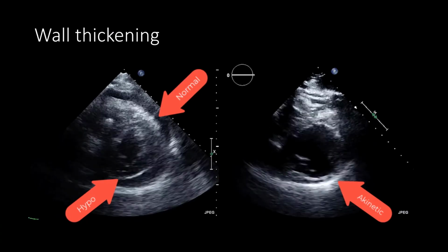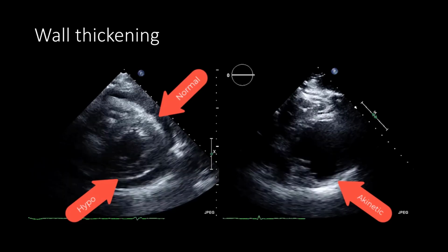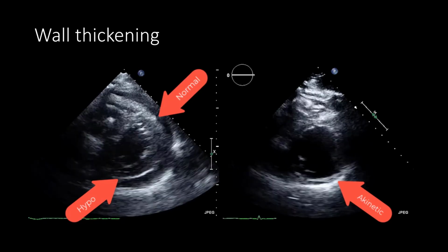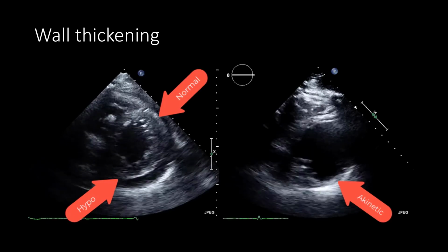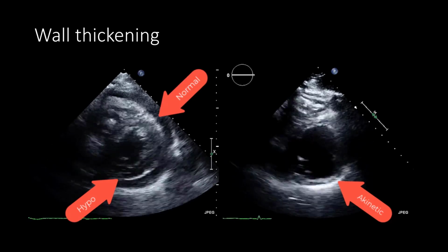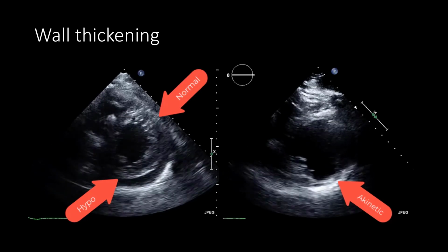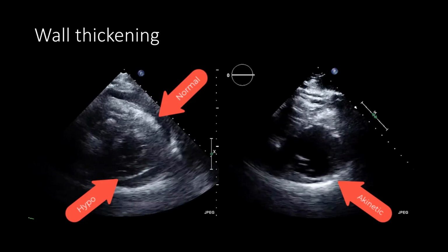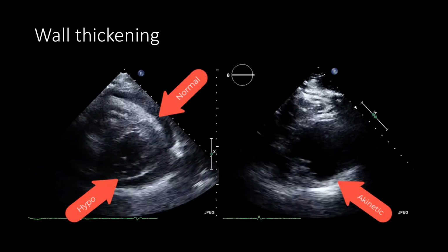With increasing myocardial dysfunction, walls can become progressively hypokinetic and akinetic. It is way easier to see differences between walls than something like global hypokinesis. I would always compare one wall to another. Even global hypokinesis is often not exactly that homogeneous. The hypokinesis shown here is quite severe, bordering on akinesis. The akinesis shown on the right is actually way past akinesis, with evidence of thinning suggestive of scar formation.